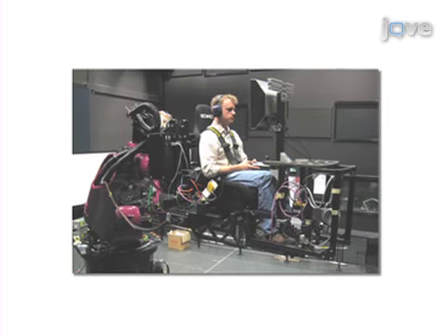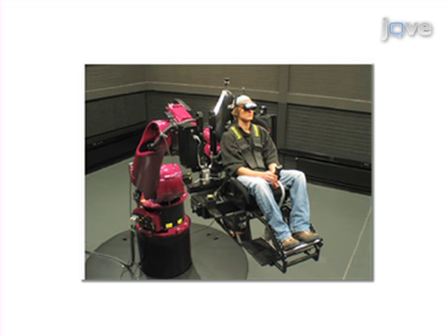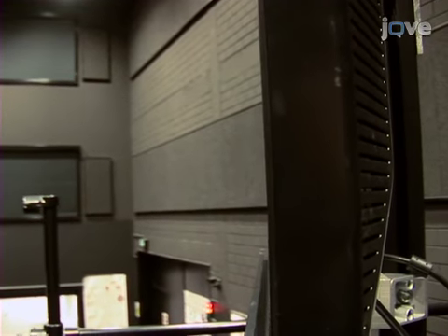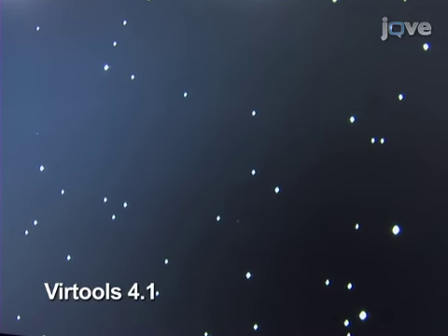Multiple visualization configurations are possible, including an LCD screen, a stereo front projection, a mono front projection, or a head-mounted display. In this experiment, visual cues to self-motion are provided by an LCD display placed 50 centimeters in front of the observers. To deliver visual cues, the software presents a virtual cuboid space filled with 200,000 dots to the participant.